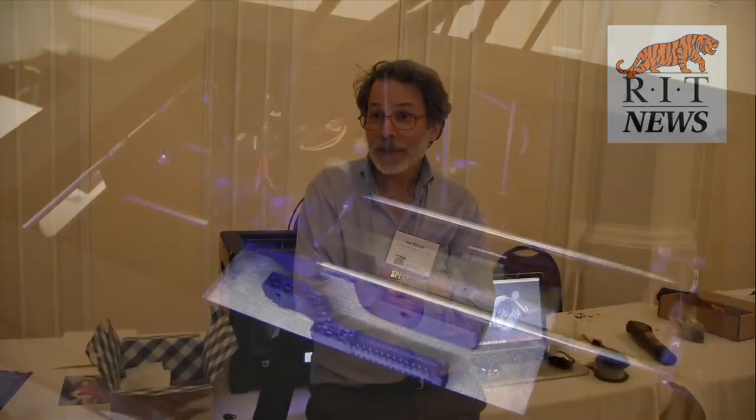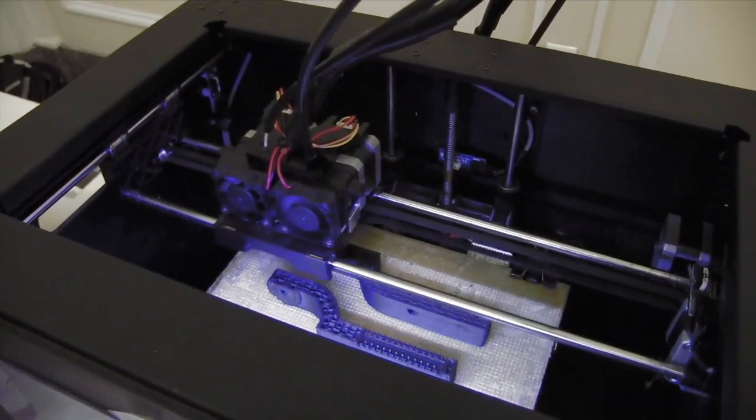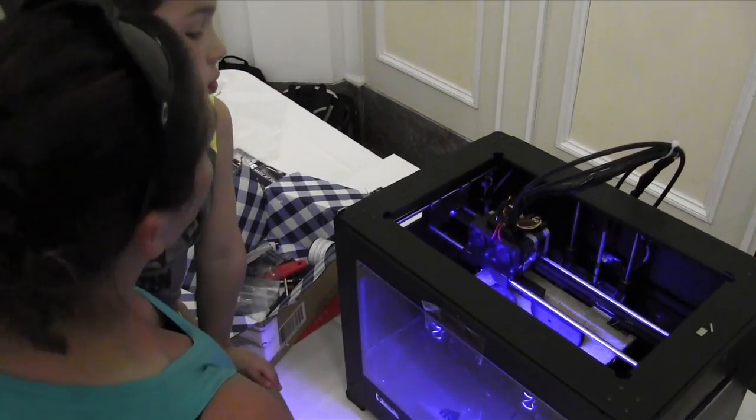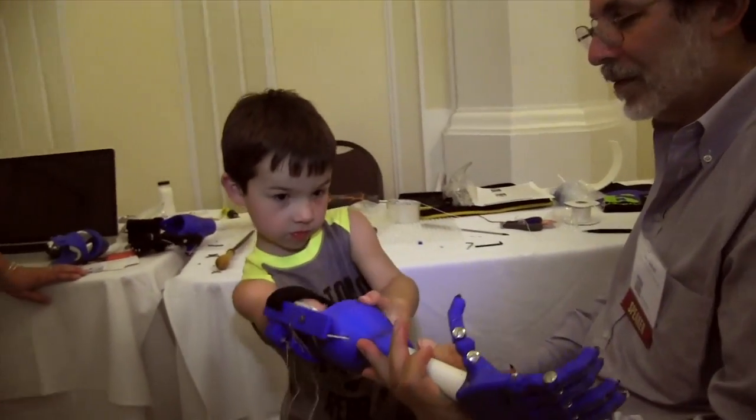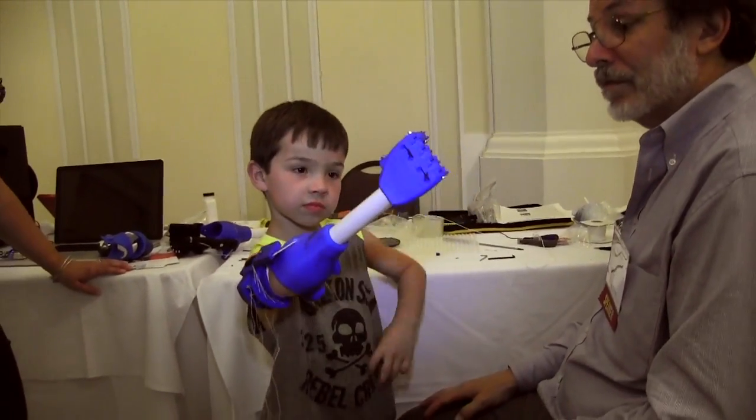I like to say that there are three essential ingredients here: one is 3D printing, the other is internet technology, the other is goodwill. You put those three together and you've really got a very powerful solution.